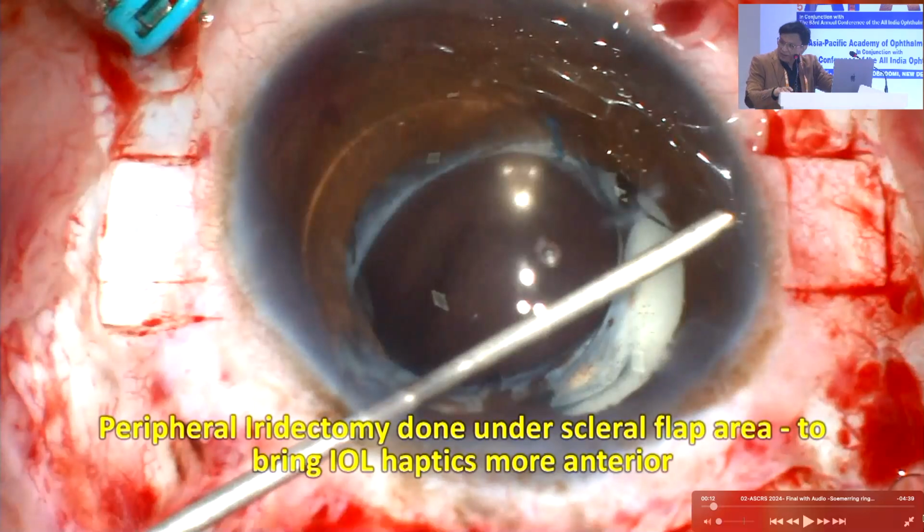So panel, let's ask David perhaps, who is our guest here. David, we have a patient there with Soemmering rings present. So the question comes, there is no capsule obviously there, the posterior capsule is gone. That lens is badly subluxed. How do I remove those Soemmering rings now?